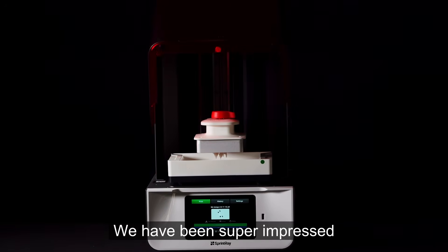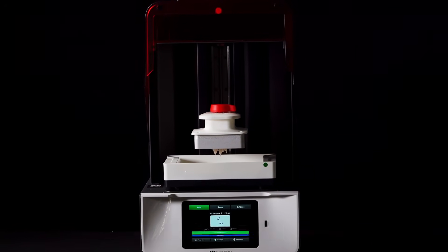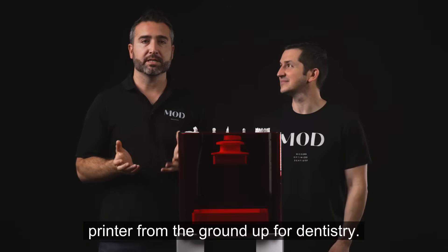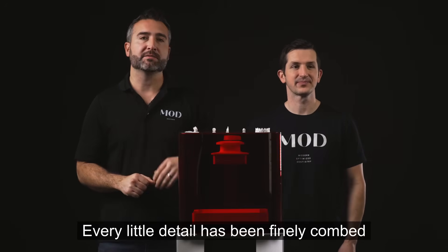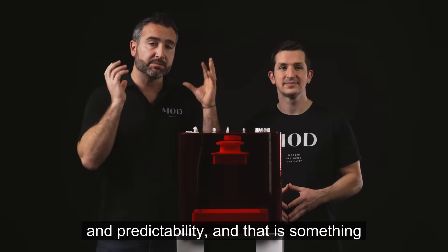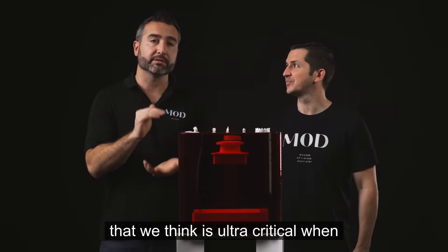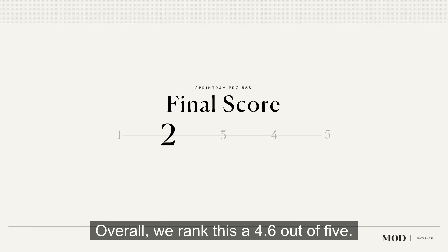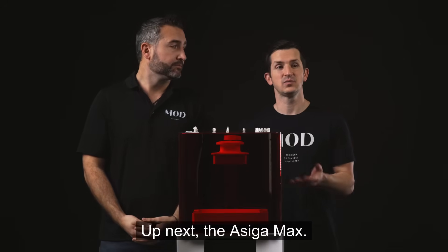We've been super impressed with this printer. It is clear that they built this printer from the ground up for dentistry. Every little detail has been finely combed over to ensure ease of use and predictability, which is ultra critical when you are printing in your office. Overall, we rank this a 4.6 out of 5. Up next, the Asiga Max.